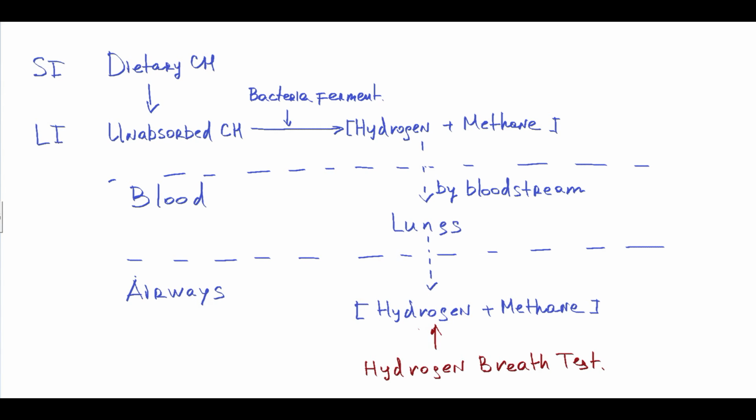And because the only source of hydrogen gas in the breath is the gas that is produced by bacteria in the intestine, this test has become useful in the diagnosis of small intestinal bacterial overgrowth, carbohydrate malabsorption, and conditions with rapid or slow passage of food.